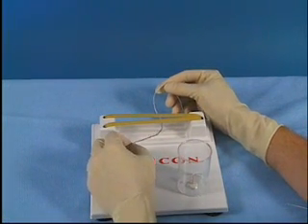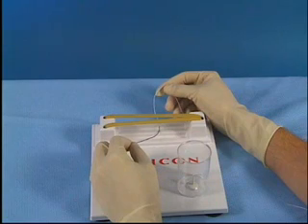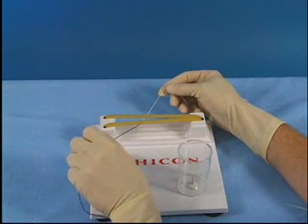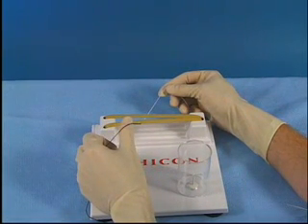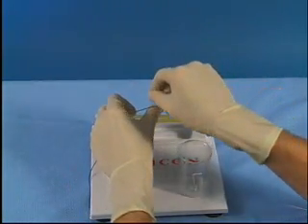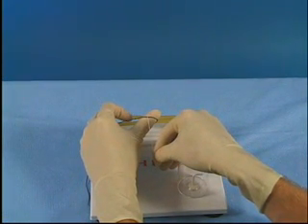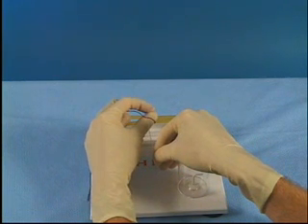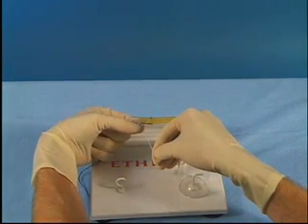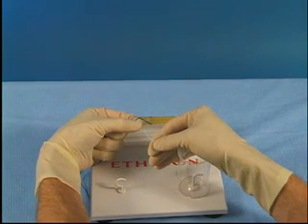The two-handed tie is begun with the left hand down and the right hand up or further away from the surgeon. The suture material is grasped and the left thumb is hooked under the suture material on the near side. The right hand is brought across the left hand, making the strands into an X on top of the thumb. The left index finger is placed on the thumb, and the hand is rotated through the loop so that the white strand or the away strand may be grasped.